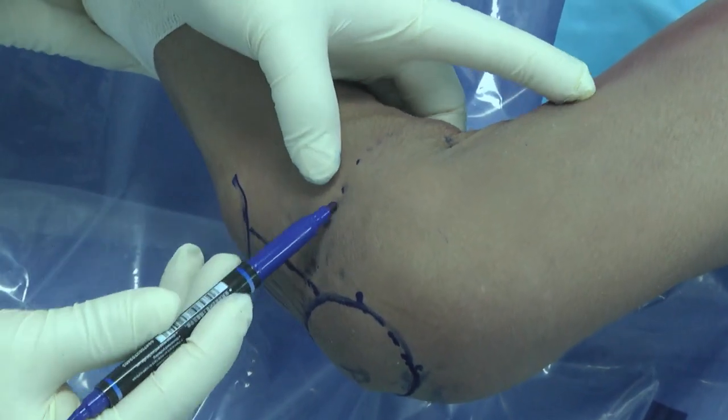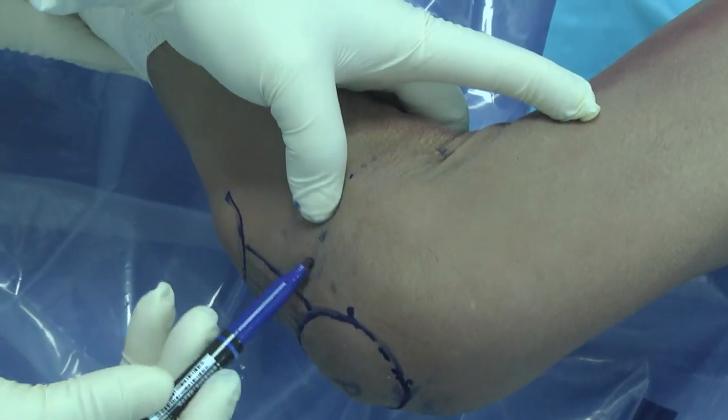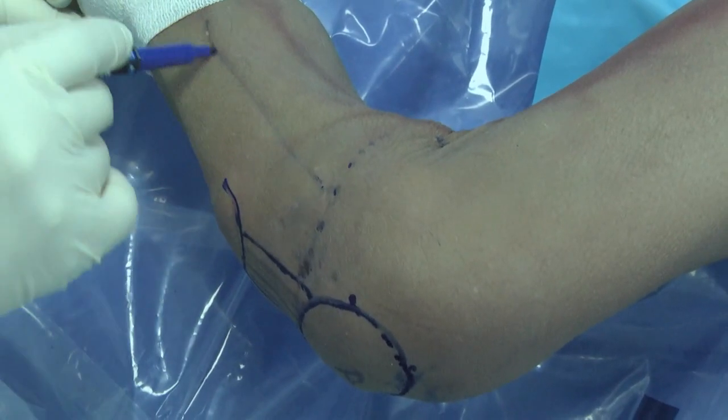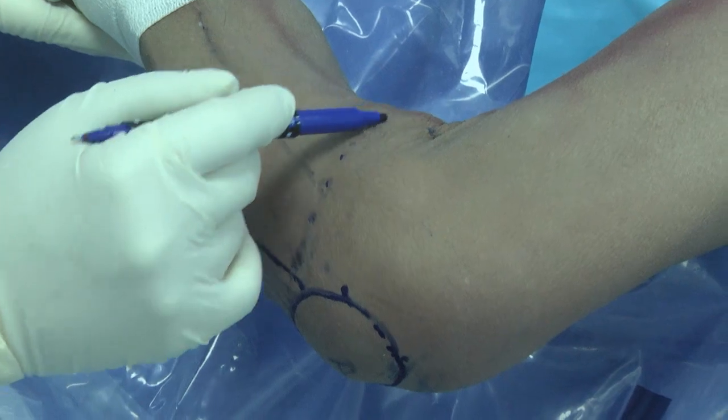Okay, and then you palpate the joint line here. You feel, you see my finger? I've palpated the joint line. 关节线。And you look at here, right? It's like the posterior slope of the joint. See?